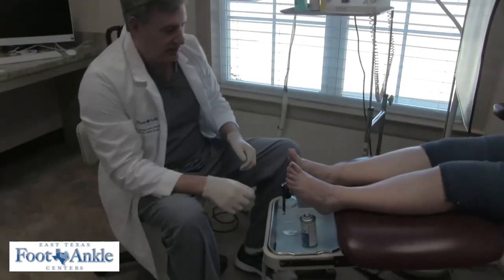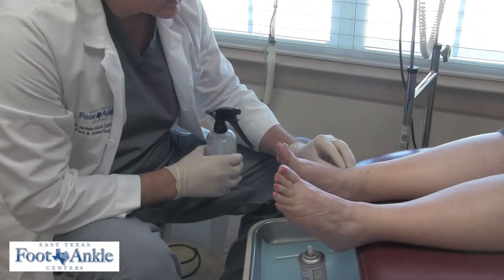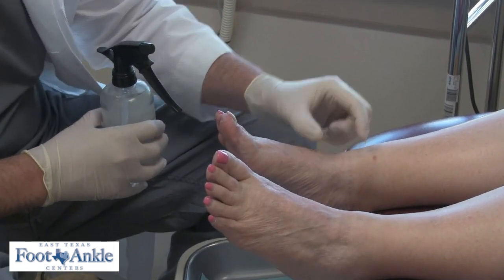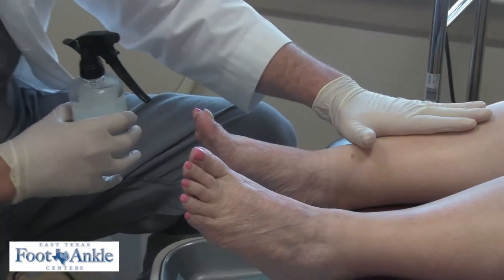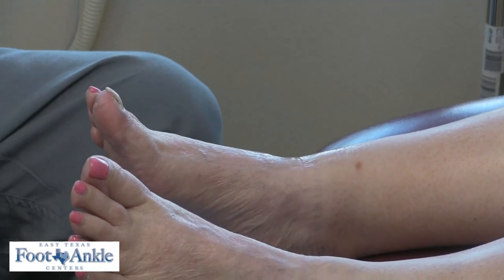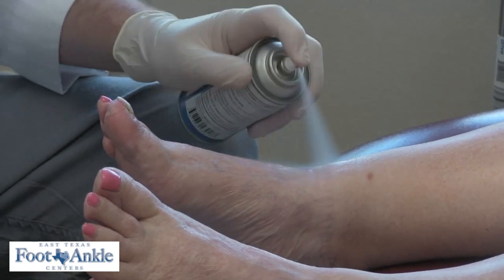So here's what I do in the beginning. I take a small surgical pen and put it right here on the ankle — that's what they recommend, either the left side or the right side. She's having more pain on the right, so we thought we'd do the one that's hurting the worst. I take a little bit of alcohol, just squirt a tiny bit right here, and then I use a little bit of cold spray — one, two, three — right on this area.